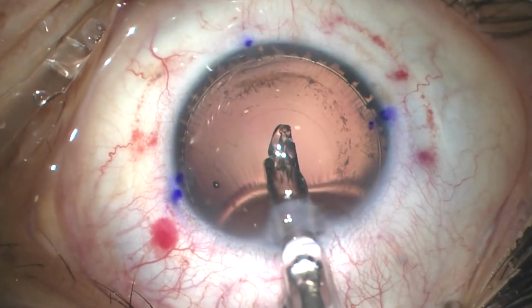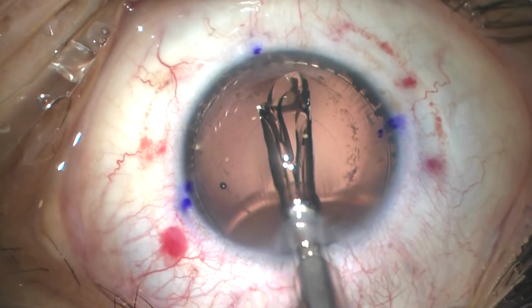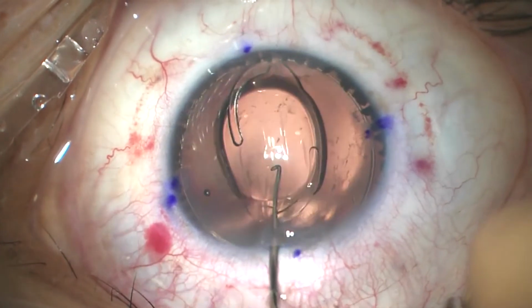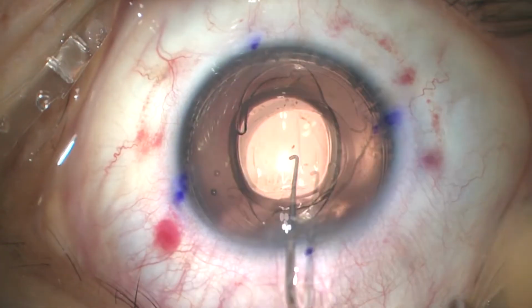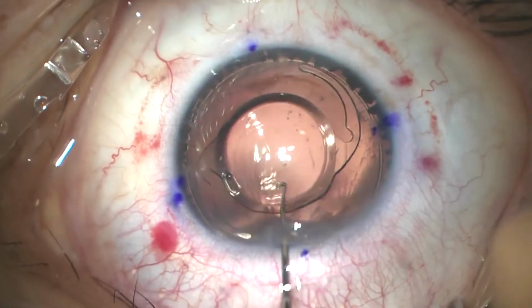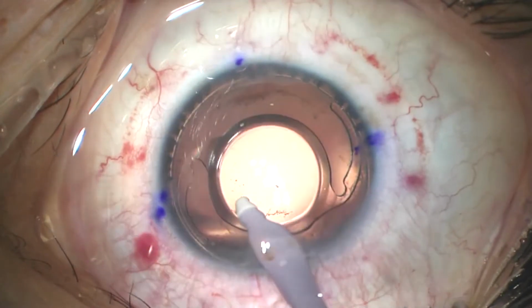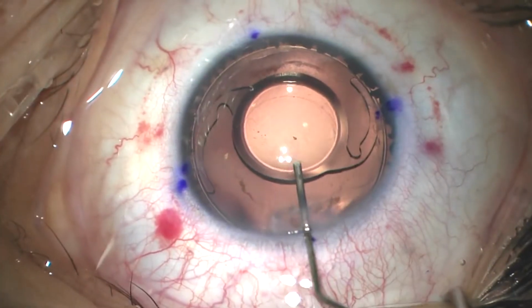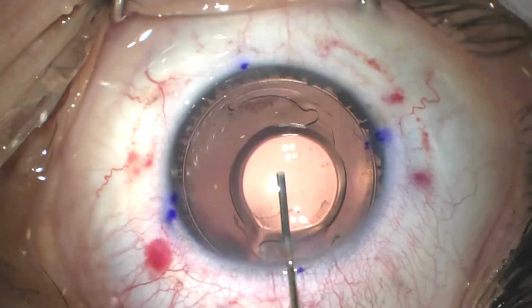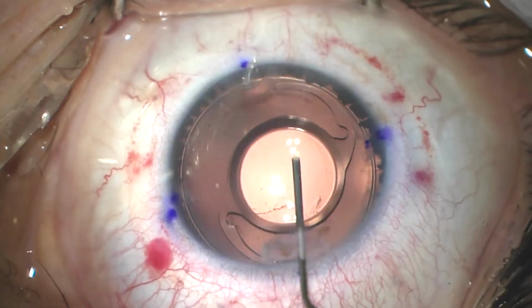Implant the extended focus monofocal lens in the capsular bag. Remove the viscoelastic from the anterior chamber and the capsular bag. And finally, rotate and center the lens.